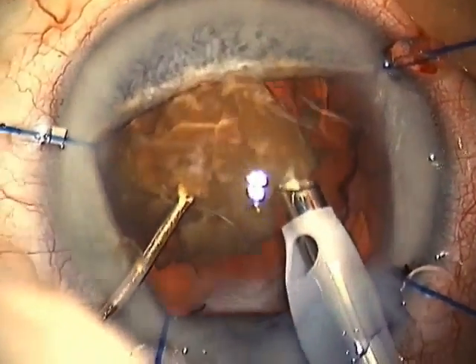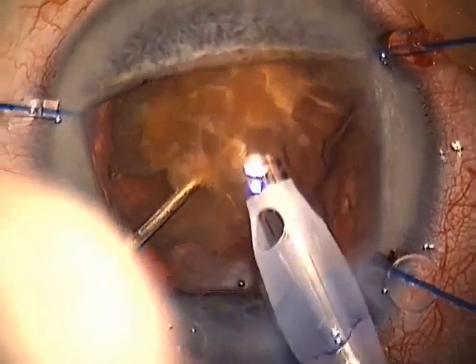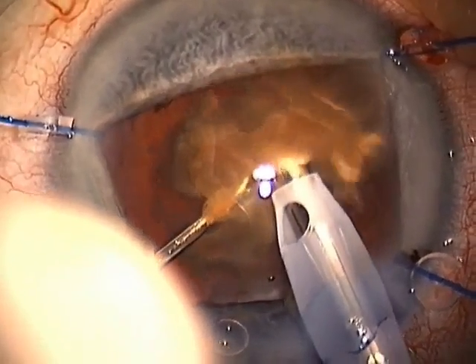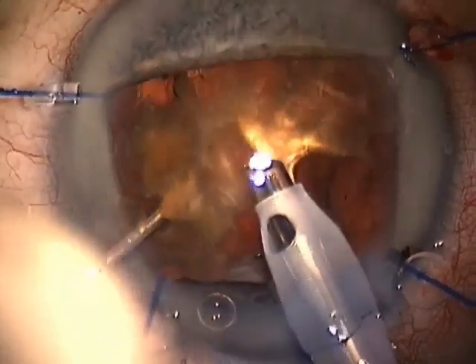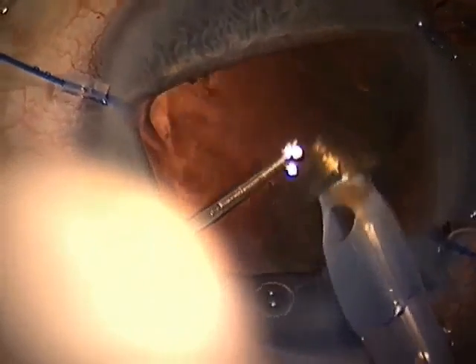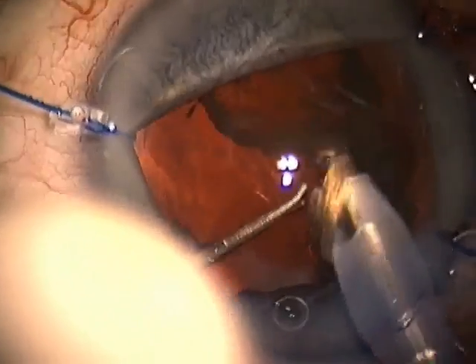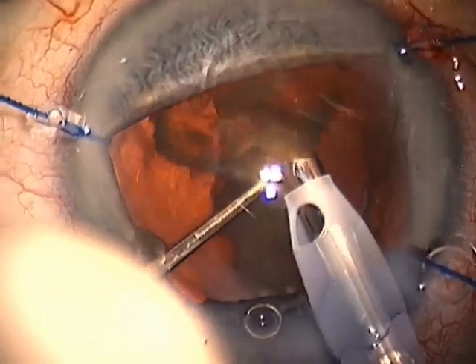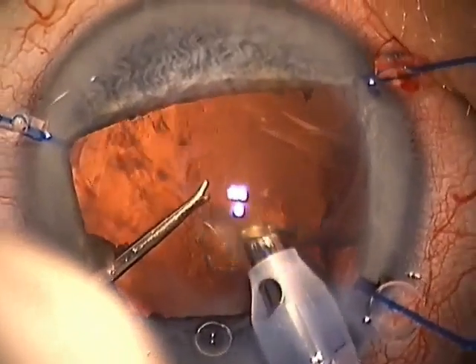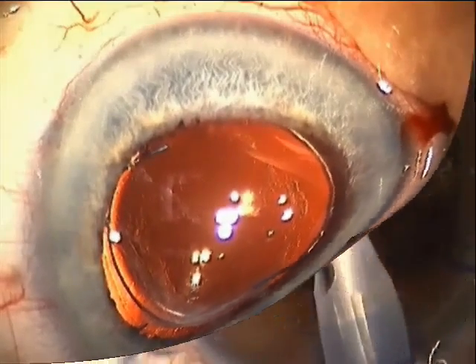That's the way David Brown taught us — you eat it from the periphery, which is softer, getting down towards the central core of the lens. When we get down to the very center, we go into sub-mode 3, which is a continuous FACO mode that just lets you go through. We've never had to take our FACO handpiece out because of it being clogged, which is a real issue with other FACO systems. In all the years we've been doing FACO flip on lenses like this, we've never, ever seen a wound burn.